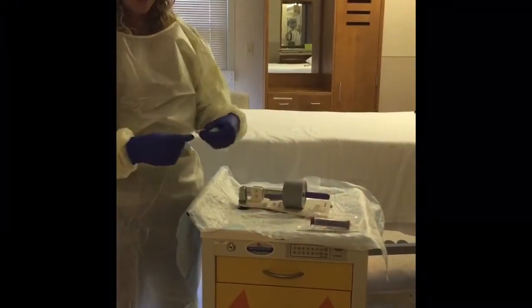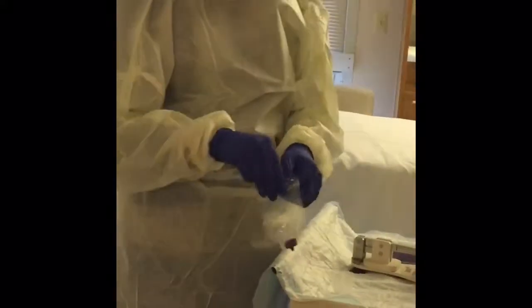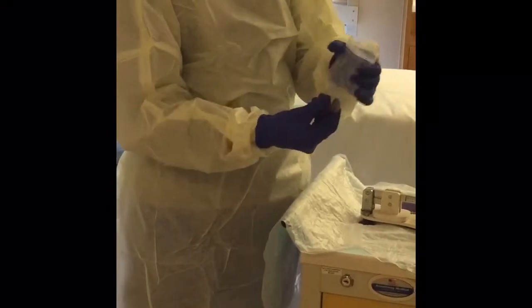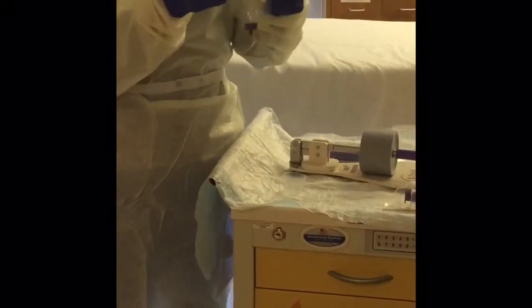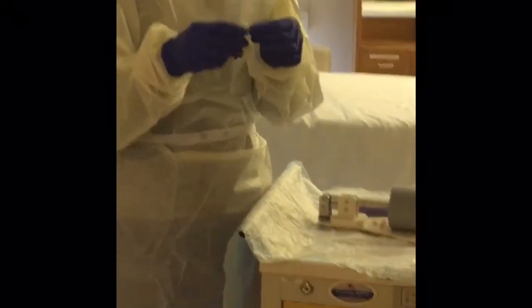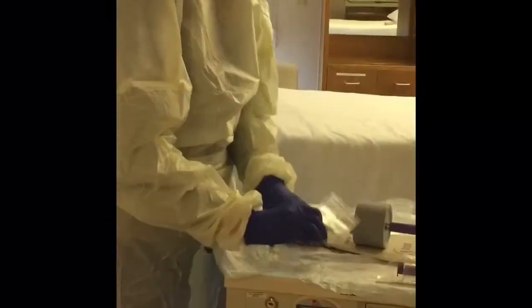So I'm going to take my pill pouch. With your pill pouch, you have this zip seal end, I think is what the manufacturer calls it. I'm going to take my pill and put it in. I would of course verify the patient, verify the MAR, and scan my medication before I start this process. But you can see the pill in the pouch there.